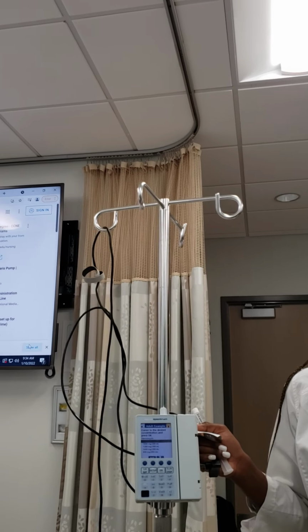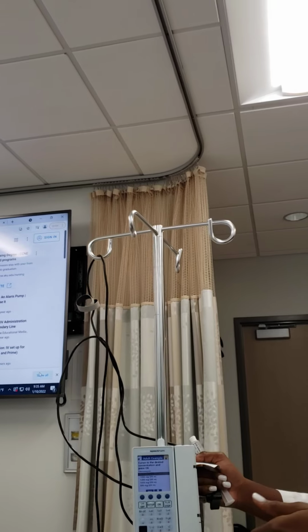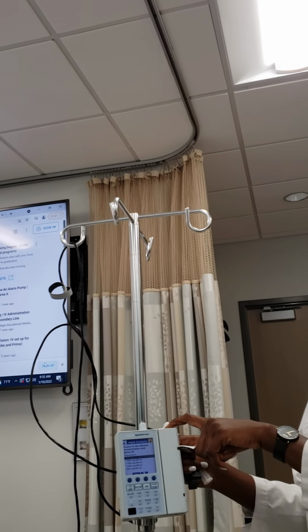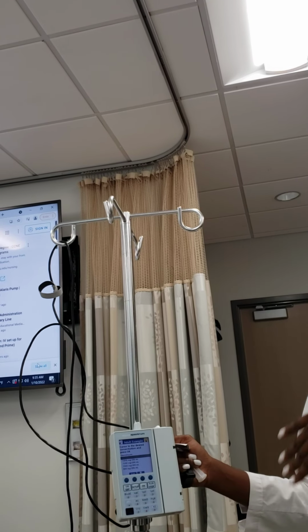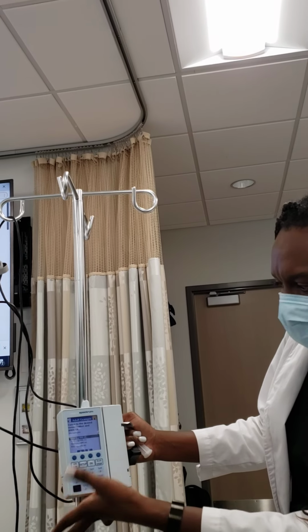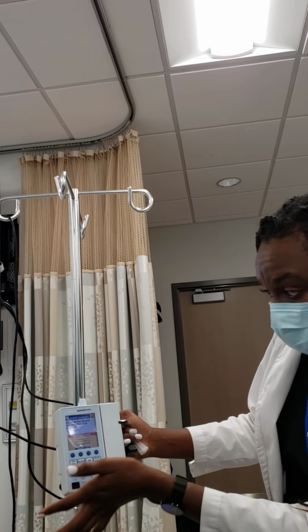Can you see? Come over. Do we need to do this to get performance? No, right? I'm just showing you because you will have to know this, I think, for advanced medicine show. But just so you know, when you go to the hospitals and you see the nurse showing you as well, then you already have an idea. So I'll just choose the first one, for example, if that was ordered.